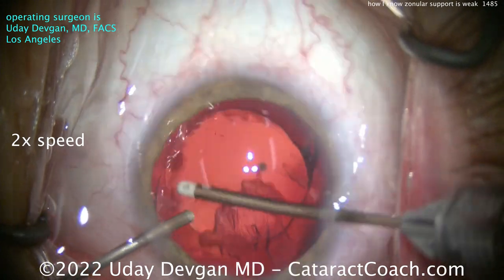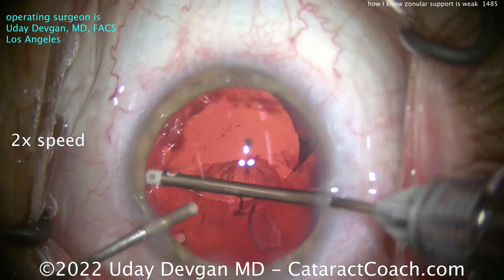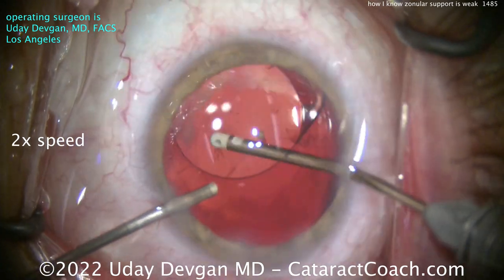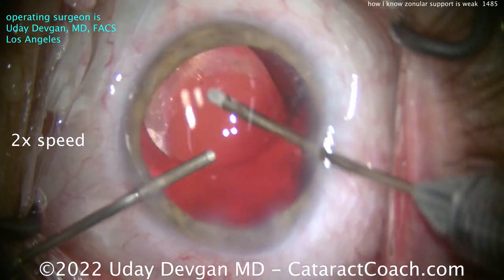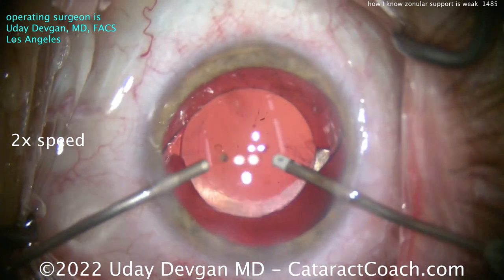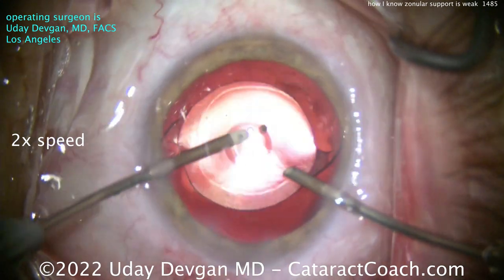I get a better grip on this stuff and a more tangential pull. Even though the IOL is already there and the capsular tension ring is holding some of the cortex up against the equator of the lens capsular bag, I can still access all of this and get it out. We're able to really clean this up quite nicely. By the way, this patient is actually a pilot with an FAA license. Let's clean up under the anterior capsular rim and do a little bit of lens capsule polishing, switching hands to get even more access.